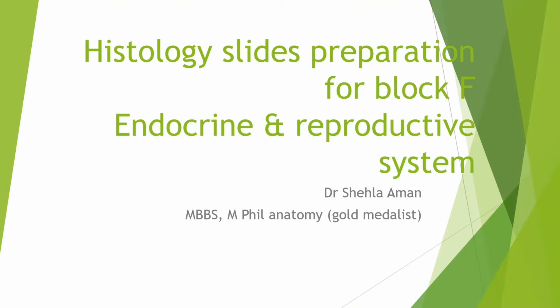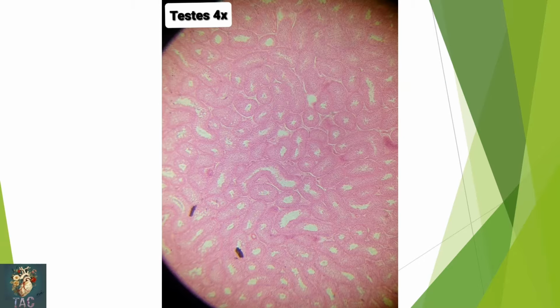In today's class of slide preparation for the block of endocrine and reproductive system part 2, we will do the male genital system and then we will do the endocrine system.